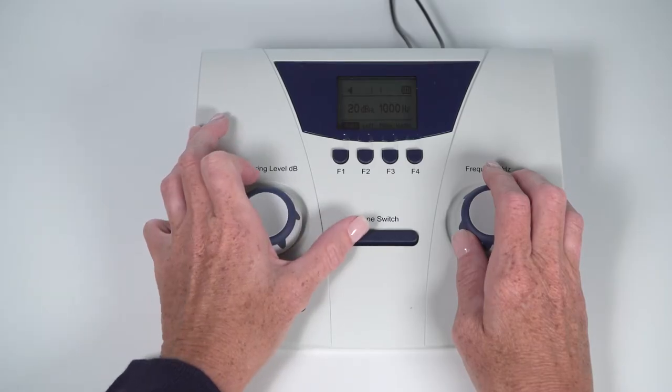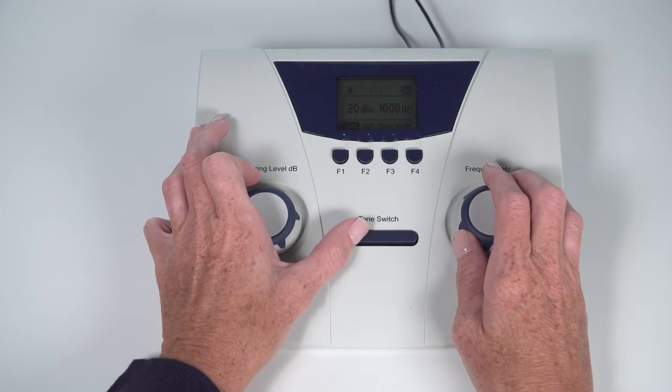The screening level is usually 20 dB. Once you start testing at the screening level, the level should remain constant for the remainder of the test.